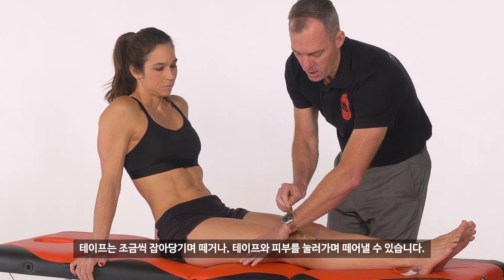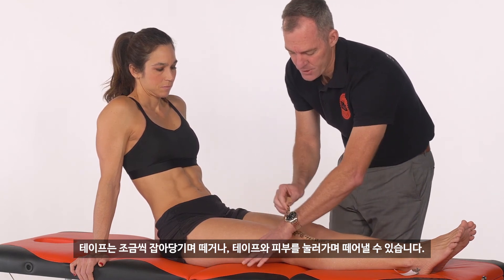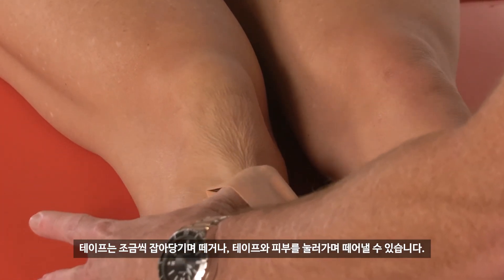The other way is to actually hold the skin down through the tape — apply pressure through the tape and then peel as we maintain that pressure.